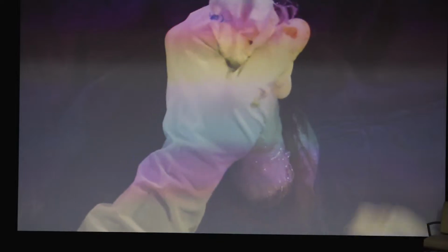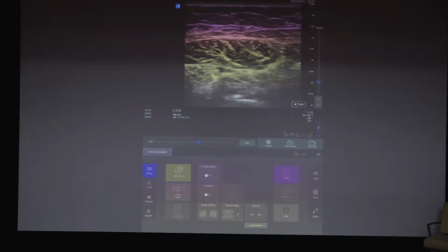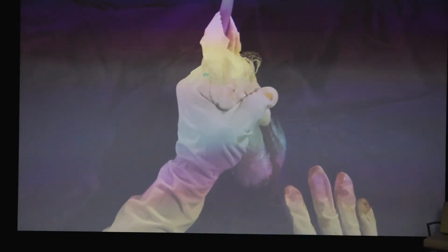Good afternoon, everybody, for the post-lunch session of live cases. We are first demonstrating a regional anesthesia block, the adductor canal block. This is a 71-year-old female, hypertensive, who underwent right knee replacement. So we are giving an adductor canal block for post-op analgesia.